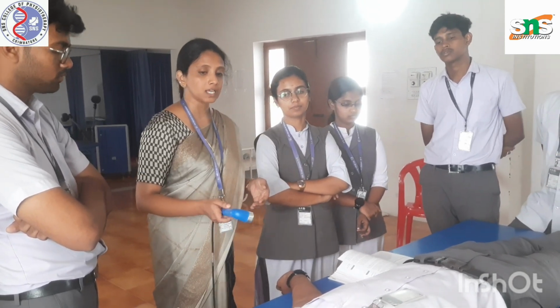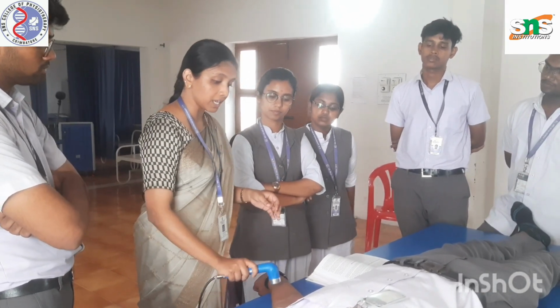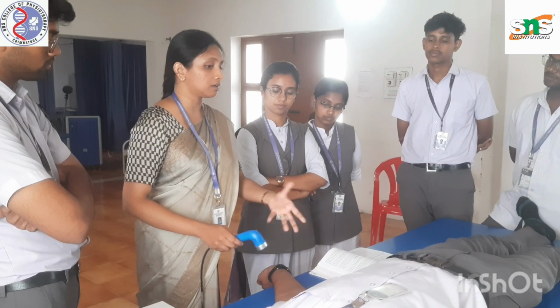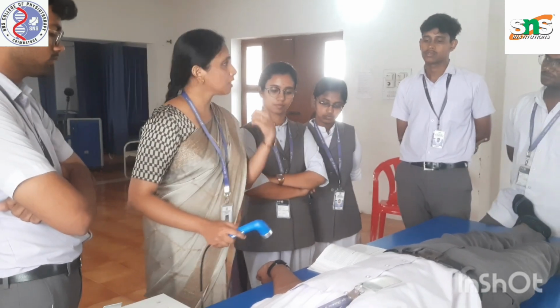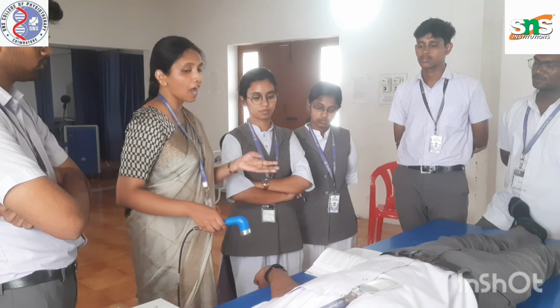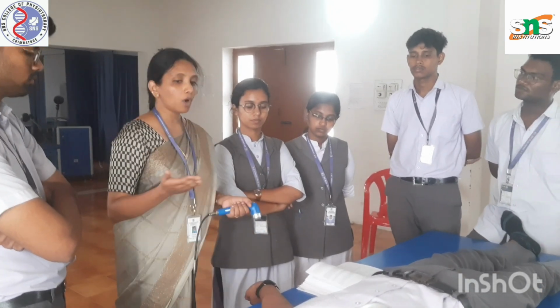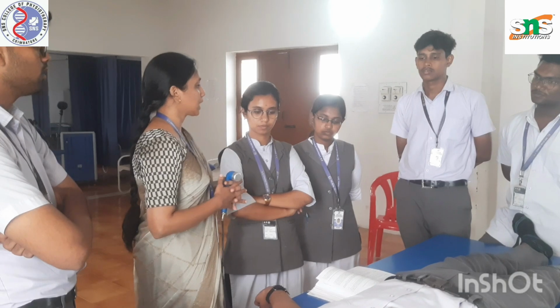Skin allergy. Yes. The allergic reaction will be aggravated if you place the ultrasound head for the treatment duration. Within 5 or 10 minutes, the allergic reaction will aggravate. Then after the treatment session, the allergy will be more. Okay. Then what are the other contraindications we can expect?